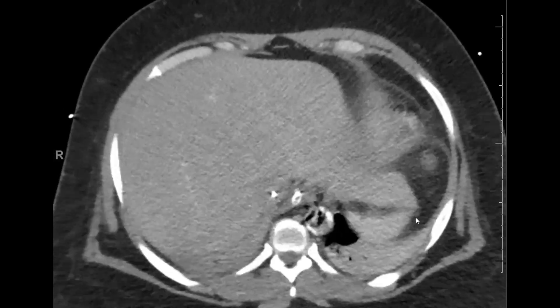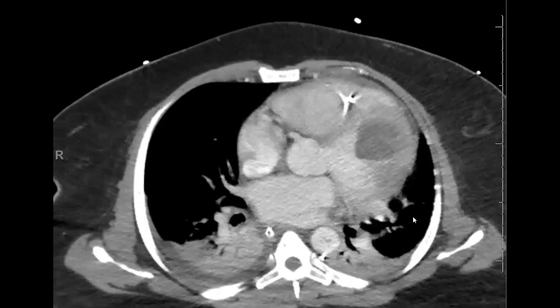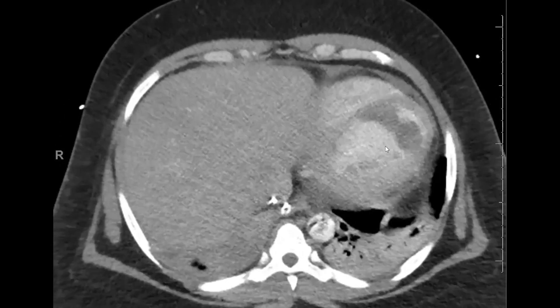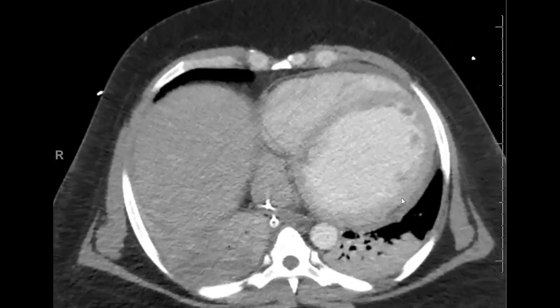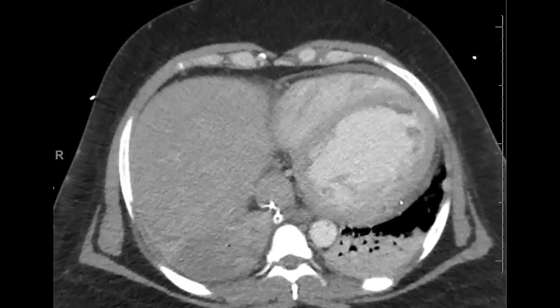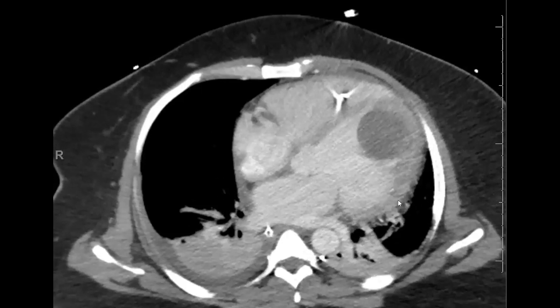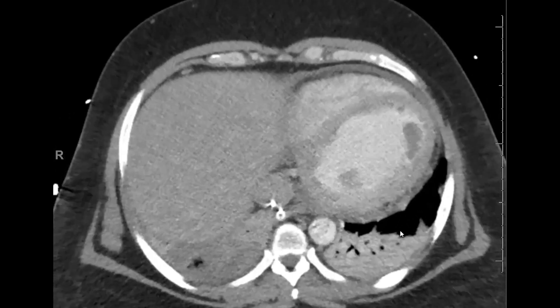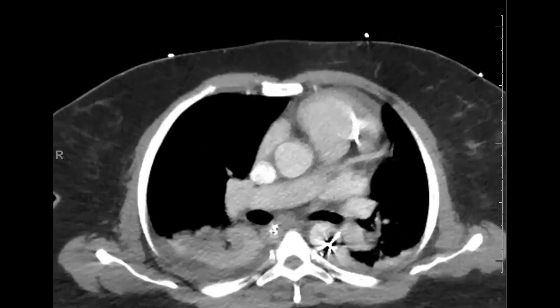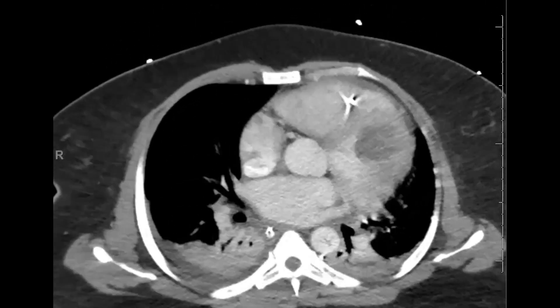These could also be evaluated with delayed imaging as well, if necessary, if the imaging is not definitively diagnosing them. In this case, it's clearly LV thrombus, so echo may not even be necessary, though it's typical for us to suggest echo to look for any other cardiac abnormalities. Most of these patients who have hearts like this already have a known history of some cardiac abnormality, and they've probably already gotten an echo by the time we've done the CT.